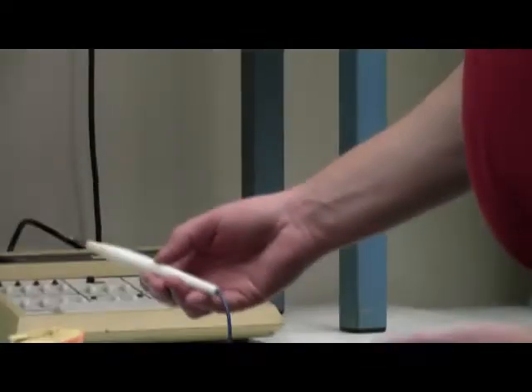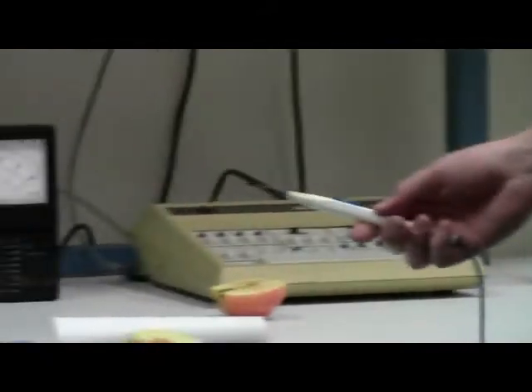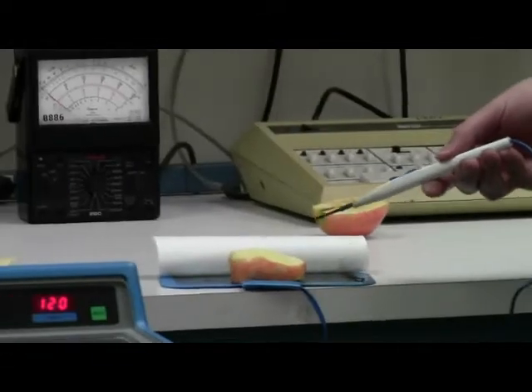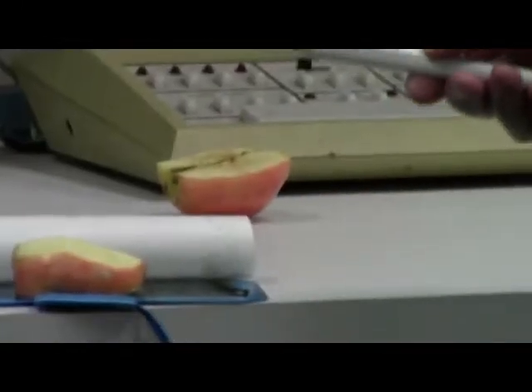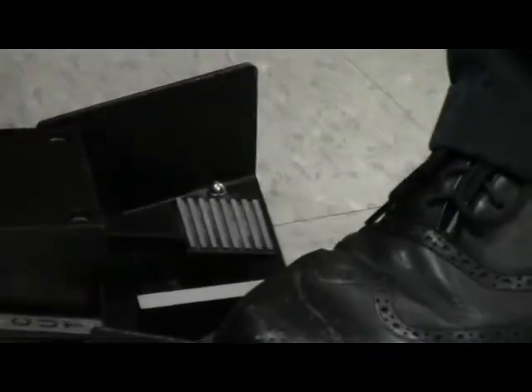We have a pad which simulates the grounding that would be placed underneath the patient. We have an apple that we're going to simulate on. I'm going to select the foot switch for cut first. You can hear the continual tone of the unit.